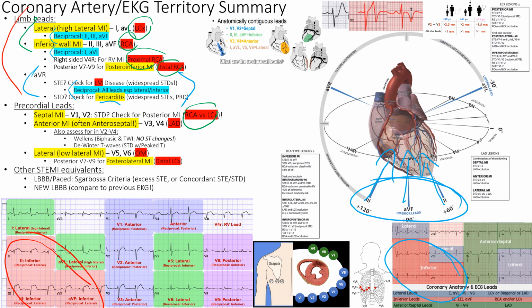And then we have these, your limb leads, right? Your limb leads are 2, 3, aVF, but which other two leads are limb leads? Remember your EKG, your 12 leads split in half. One half is limb, the other half is chest leads, also called precordial leads, right? So to finish out the picture of our limb leads, you've got 1, aVL, and then you have 2, 3, aVF, and our stepchild aVR, right? Those are our limb leads.